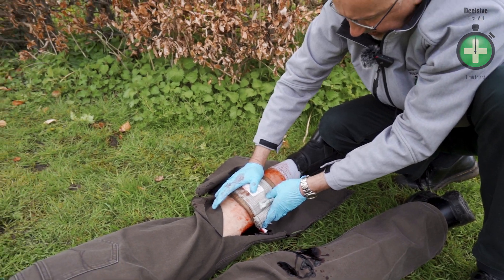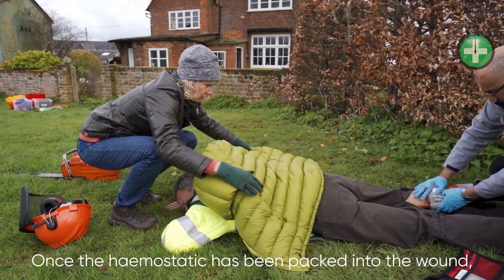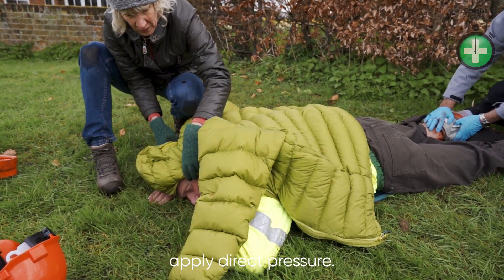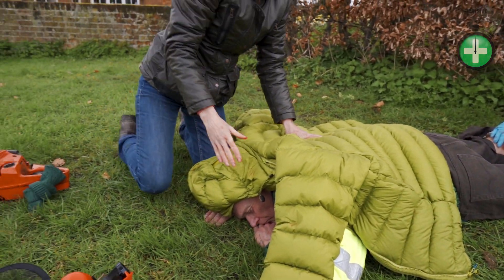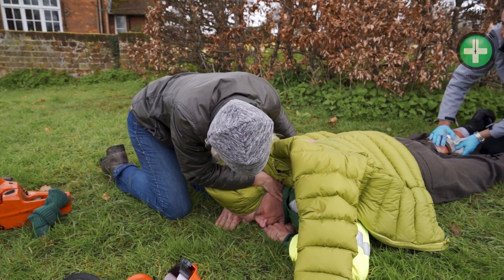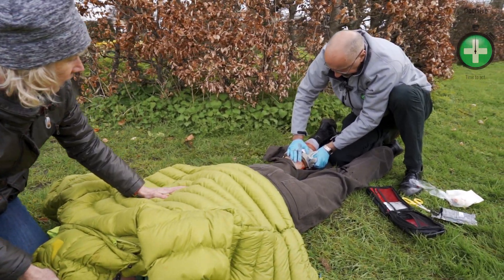I'm also looking to see if there's any active bleeding. I've got the coat on. I'm happy the bleeding has stopped. Can you check his airway and that he's breathing? He's breathing. Excellent. We've got the catastrophic bleed under control. He's got an airway and he is breathing.